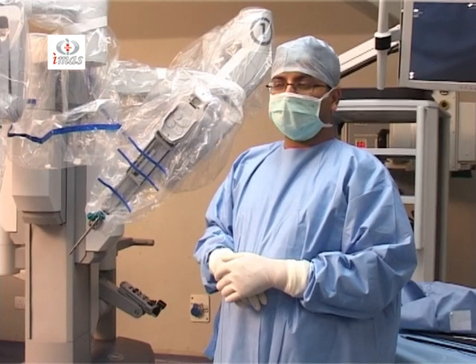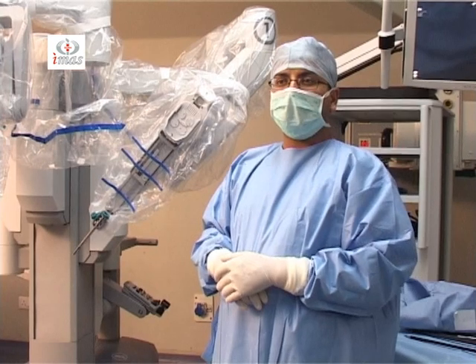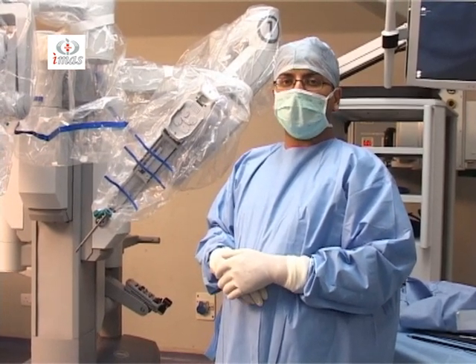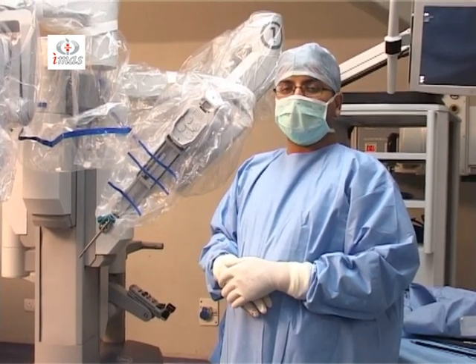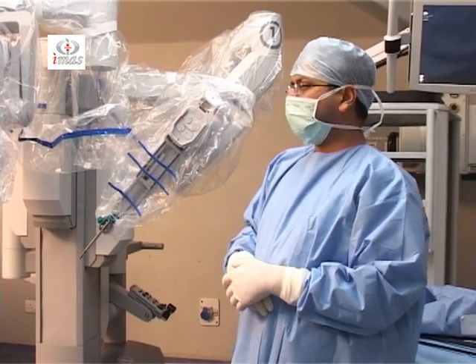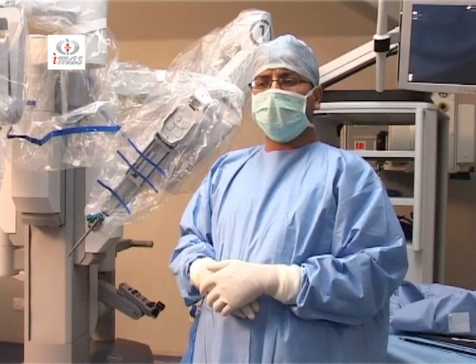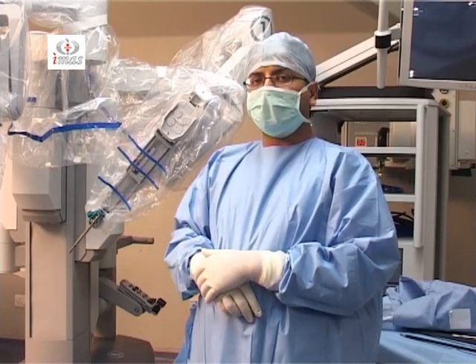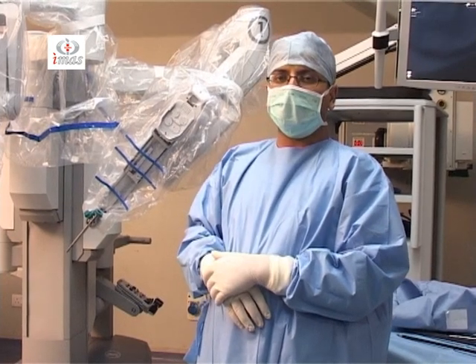The better variants of this system are expected in near future, especially because of lack of haptic feedback in this system, which can be taken care of in the future systems. And as of now, this is a bulky equipment, needs special technical training to run the system. So all these shortcomings along with the cost should be overcome within next few years.